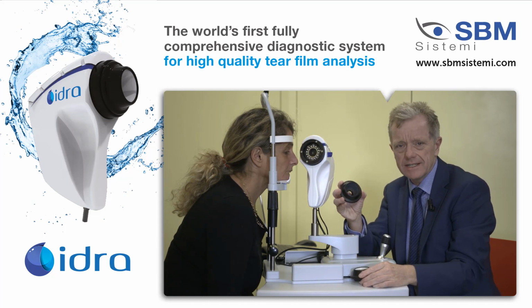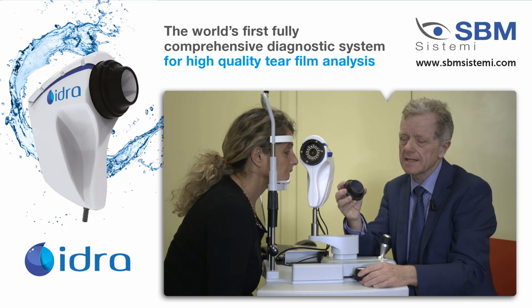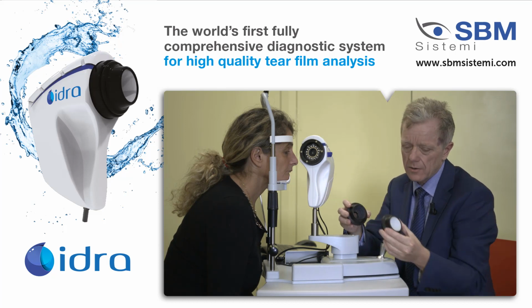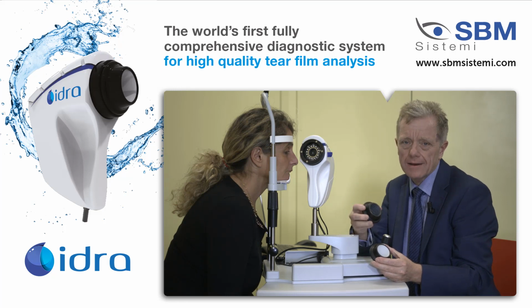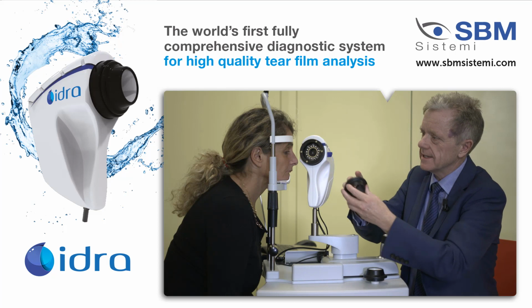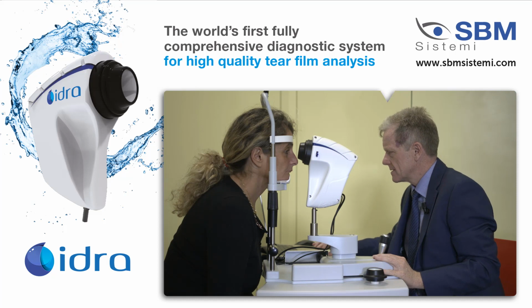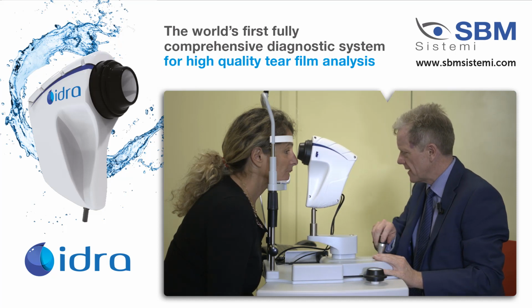So we have a Placido disc cone, which sits on the device, and this allows us to look at tear breakup time. And we also have another device, which is a white cone, which looks at the interferometry, the quality of the meibomian gland function and that lipid layer. So it's quite easy to put these cones on the front of the device and then just, with the device, look at obtaining some of the images.